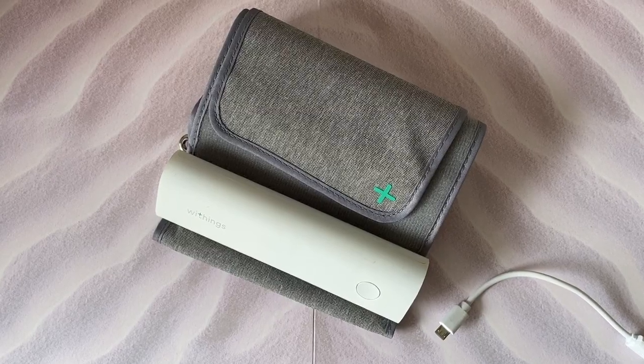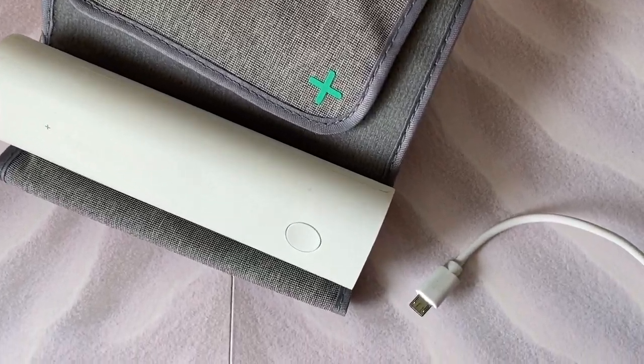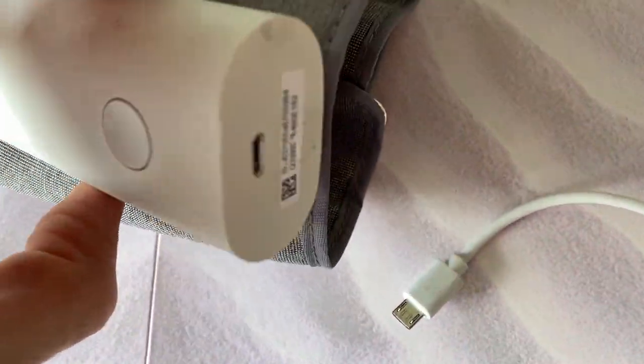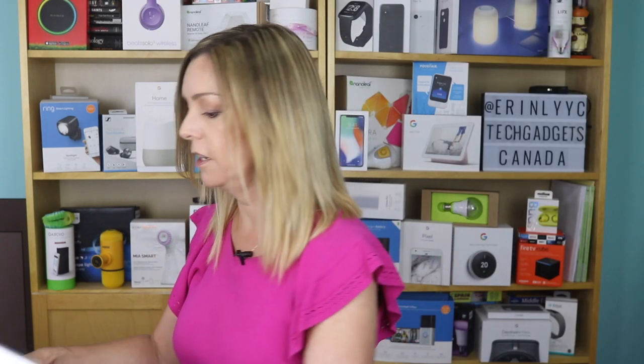The Withings BPM Connect is rechargeable and the company says the battery should last about six months. When it is time to recharge it, you'll just use the micro USB port in the bottom. Getting the device set up is easy enough. You'll set up or log into your Withings Health Mate app account and pair the app to your blood pressure cuff. With that done, you will be able to take a reading. Let's take one now so you can actually see how it works.